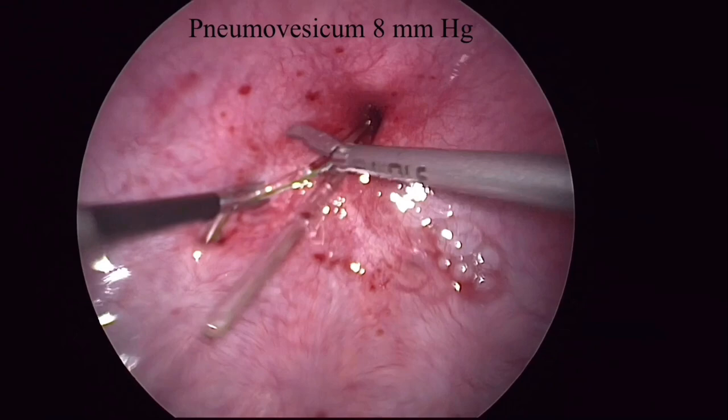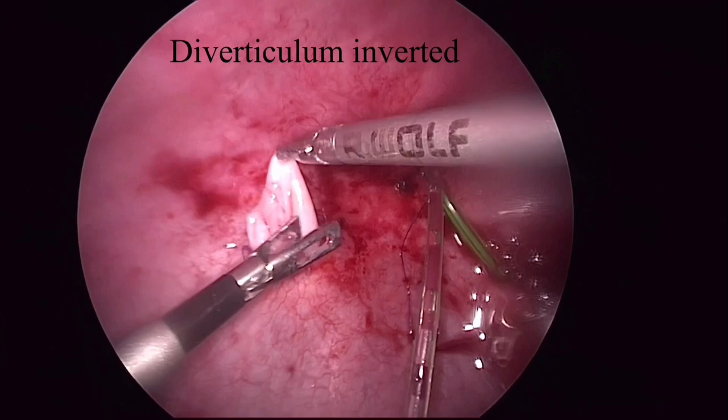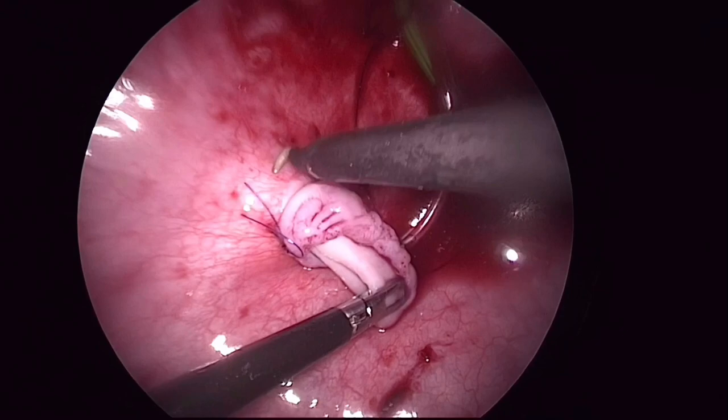We can see the roomy left Hutch diverticulum. The diverticulum is then inverted into the bladder. A plane is then created between the diverticulum mucosa and the detrusor.